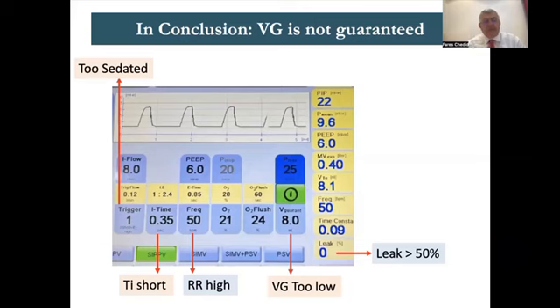The triggering: don't sedate the patient too much or paralyze him, because if the patient is too sedated, he cannot trigger. As I said, untriggered breaths need more PIP. Another aspect is to set the trigger sensitivity as low as possible. Start from high and go down until you see the patient taking breaths. The color of the graph here will change because the breaths are triggered. Then you stop there, and you say, this is the trigger he wants. So allow the patient to trigger by changing the trigger sensitivity.